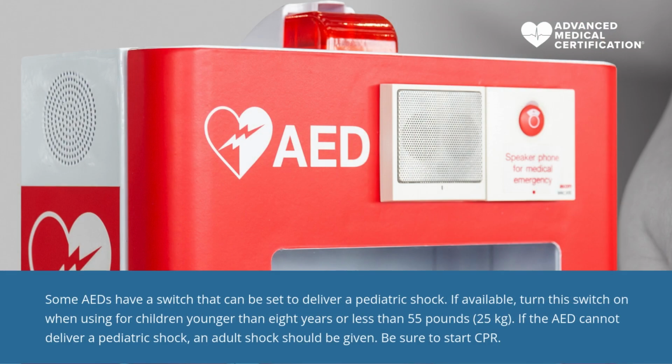Some AEDs have a switch that can be set to deliver a pediatric shock. If available, turn this switch on when using for children younger than 8 years or less than 55 pounds, 25 kilograms. If the AED cannot deliver a pediatric shock, an adult shock should be given. Be sure to start CPR.